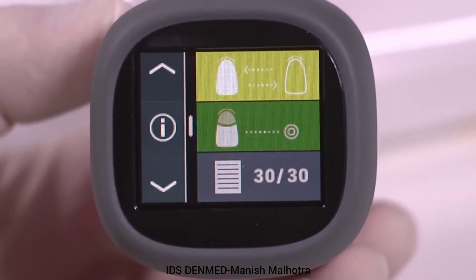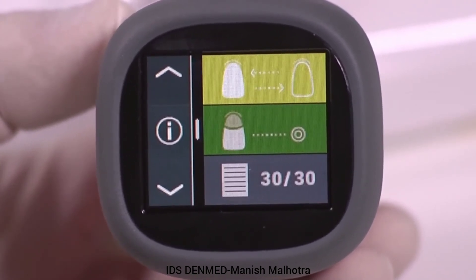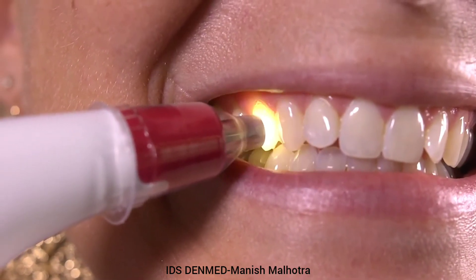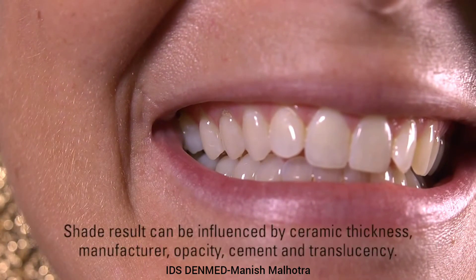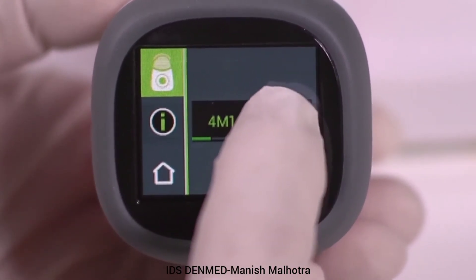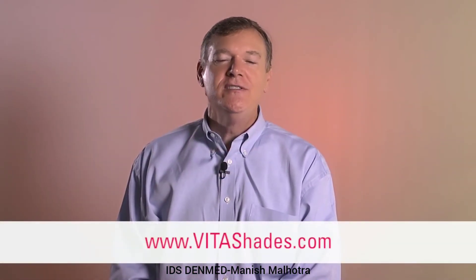This function is used to measure an unknown ceramic restoration and displays the closest Vita 3D Master and/or Vita classical shade. Step 1: Select the ceramic shade measurement symbol to bring up the measurement screen. Step 2: Measure the ceramic restoration. The shade result will reflect the area of the tip placement. The base color is usually found within the middle third of the restoration. Shade results can be influenced by ceramic thickness, manufacture, opaque, cement, and translucency. The closest Vita 3D Master and/or Vita classical shade will be displayed. Extended shade information can be displayed by selecting the color bar. For more information, please visit us at www.vitashades.com.